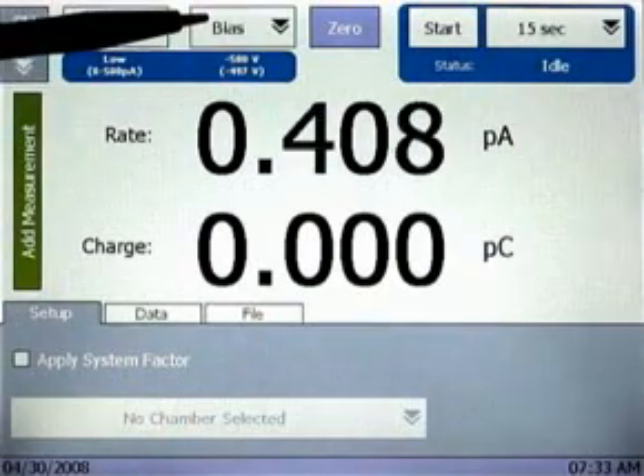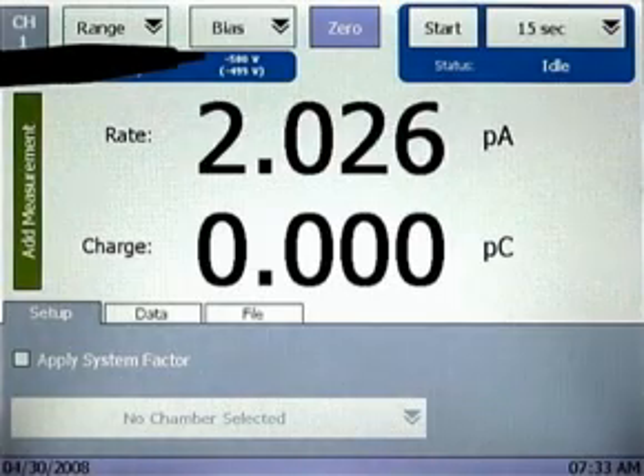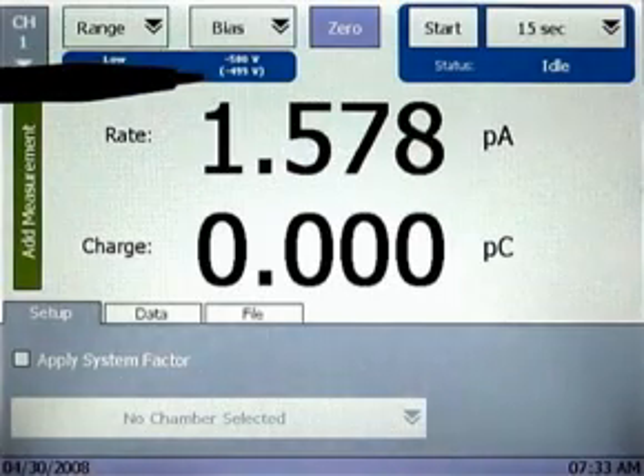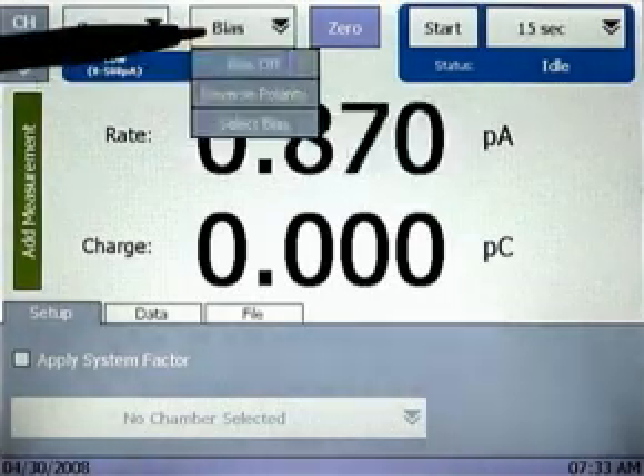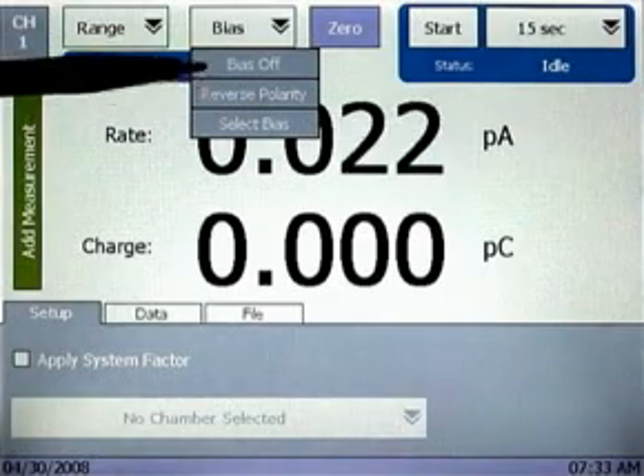Below the bias menu, two values are shown. The top value is the setting — negative 500 — but also shown is the actual measured voltage. Looking again at the bias menu, there are also quick links to reverse the polarity and turn off the bias entirely.